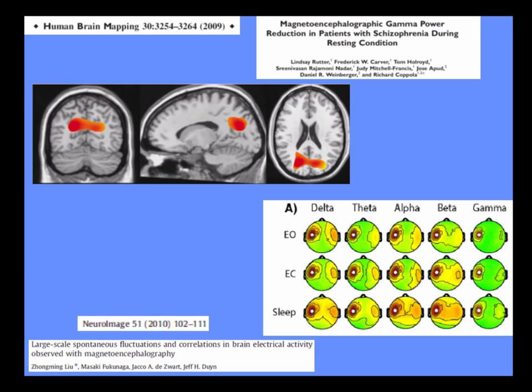I mentioned gamma power. This is actually now a higher gamma band, not very high gamma, and this is sort of resting state data. This is not connectivity yet. This is just localization on resting state data. And we have a difference in this slightly higher but not very high gamma band, which shows a deficit of gamma power in precuneus in schizophrenic patients.